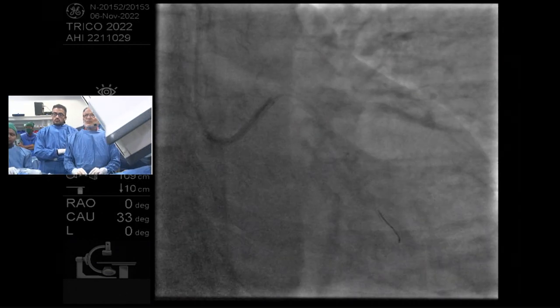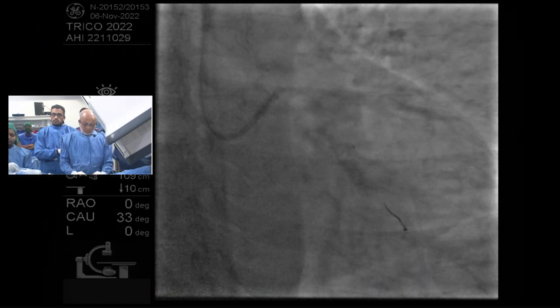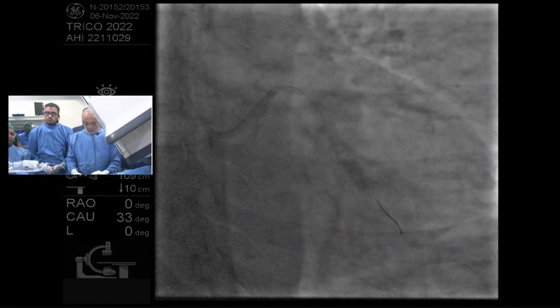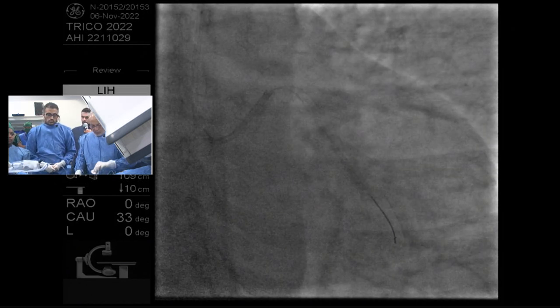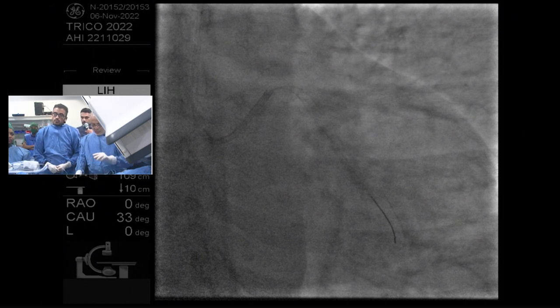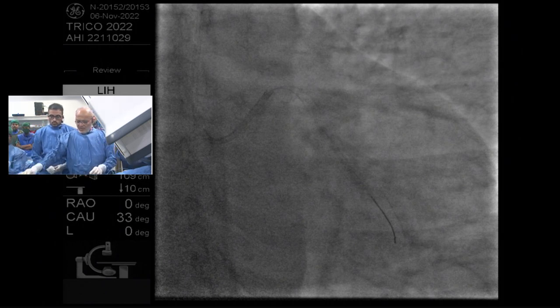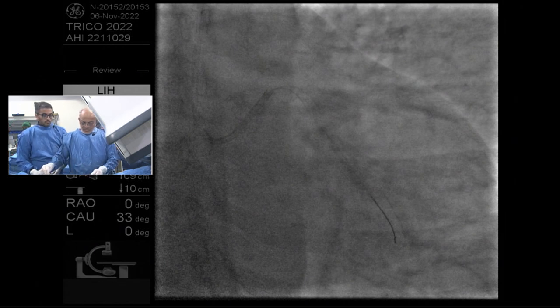And the key with that wire is to try to get it to sit on the lesser curvature of the vessel, right? So this is not the one where you knuckle it and you push down so the wire pushes up against the greater curvature. You keep it unknuckled and you allow it to lay on the lesser curvature of the vessel, so any workhorse wire. No, keep this wire, take a second wire, okay, and put it into OM1. Get me another wire. And whatever wire you have in the circ, just push that down all the way, make sure it doesn't come out because that's going to be your working wire.